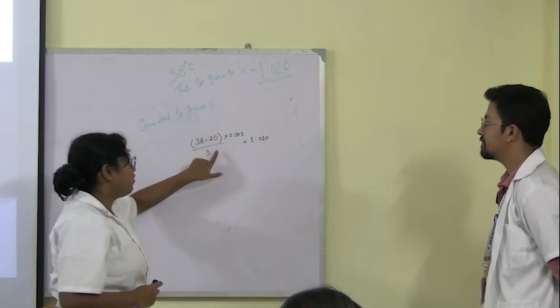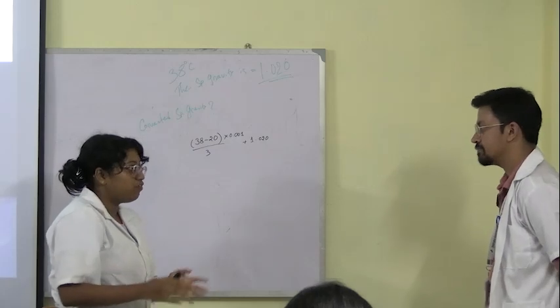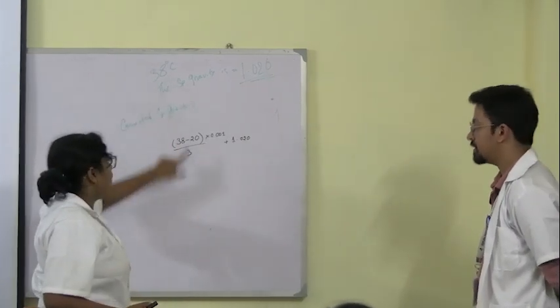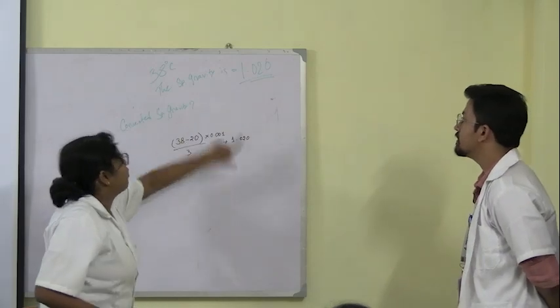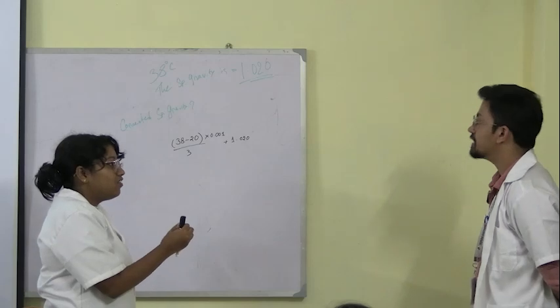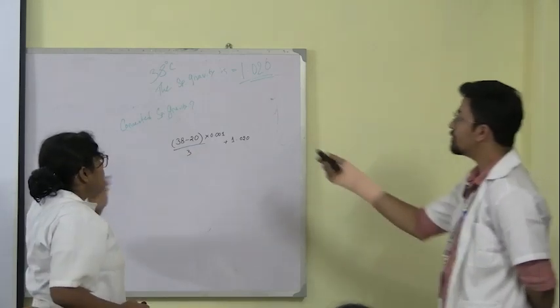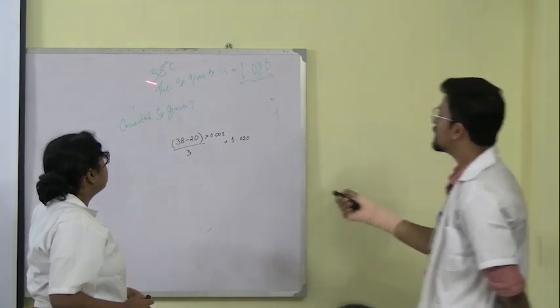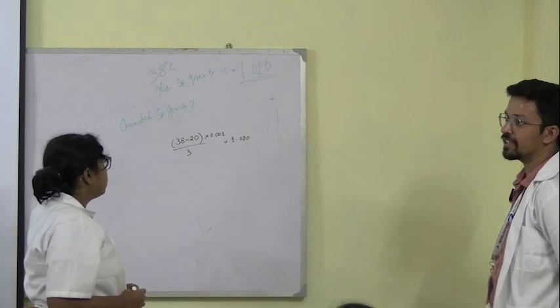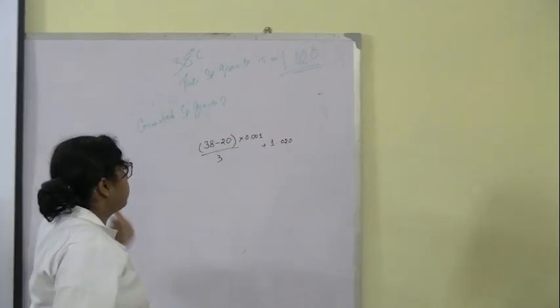That's the standard temperature, because if we go to a different region, the temperature can be different. So we take a standard temperature. The temperature is given, and the specific gravity is given here. This much is the change for each 3-degree change. That is why you first measure, see over here, the room temperature is given as 38 degrees. We have to measure at 20 degrees centigrade. And for each 3-degree change, the specific gravity will change by this much, 0.001.